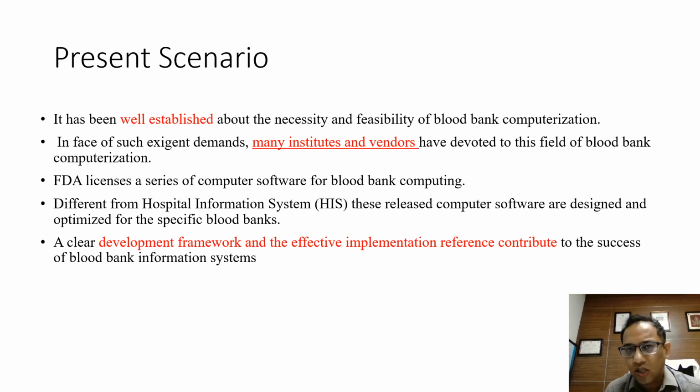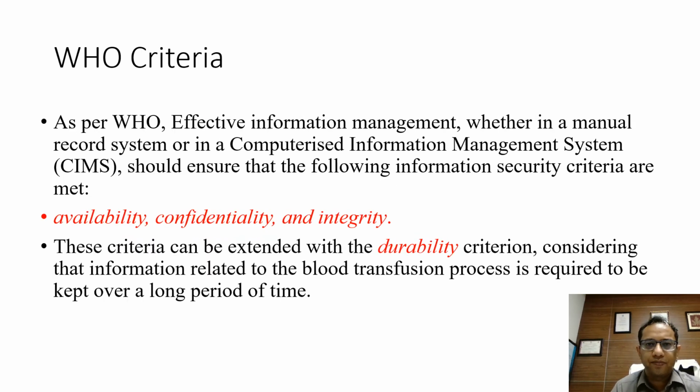There are many vendors in India as well as abroad. These vendors will come out with their software and tell you the USPs of each software, and it is up to you how you want to select it or not. The FDA licenses a series of computer software. Different from the HIS system, these related computer software are designed specifically for blood bank needs. A clear development framework and effective implementation reference contribute to the success of blood bank information systems.